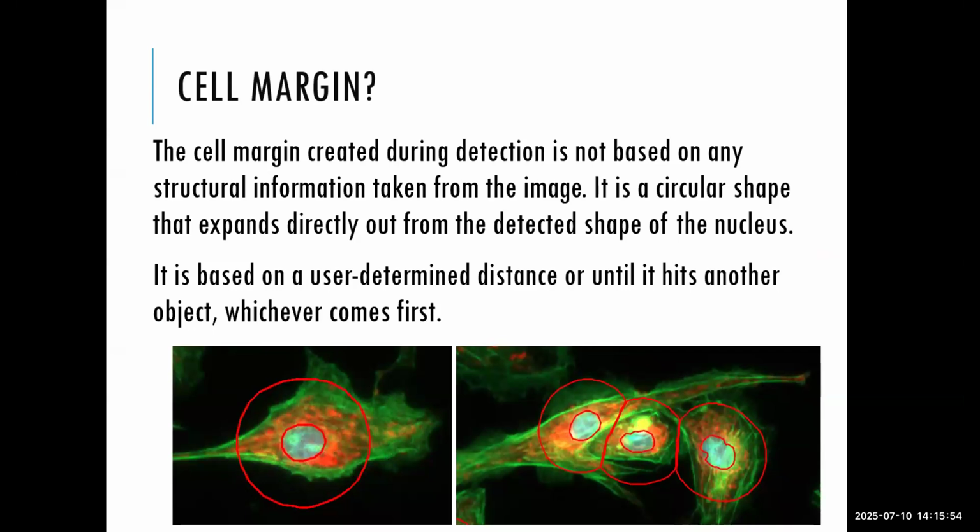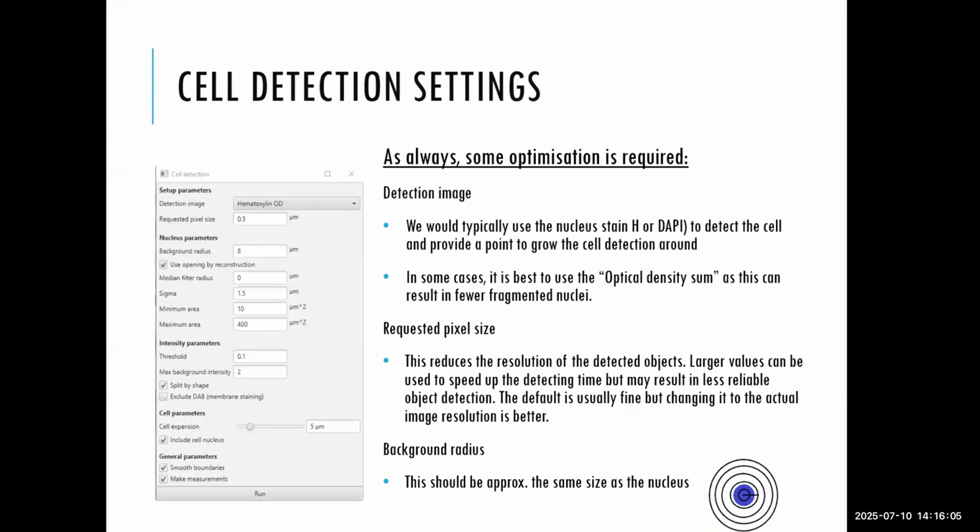However, you can do cell counts, and from that you can do detection of another marker, for example, DAB, in that general location. So just be very aware of that.